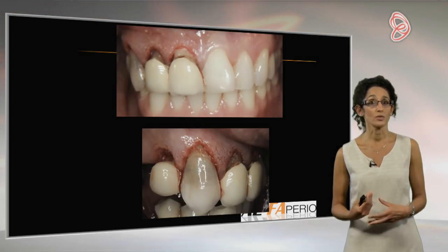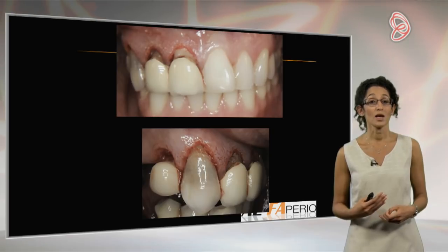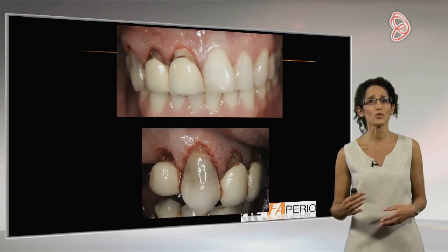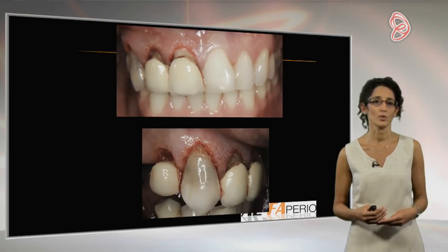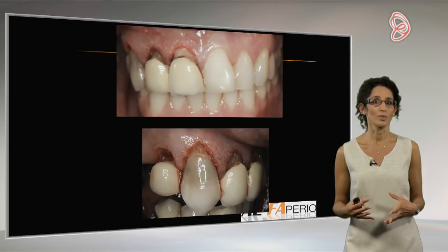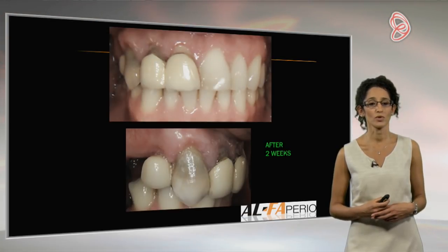So this is it after the bone and tissue removal. Again, I'm working freehand in this case, but you can see how we've tried to match up the gingival margins. And on the lower photograph, you can see how I've kind of gouged out the pontic area. But of course, we've done it with lasers, which makes it much easier to do. It would be very difficult to do that with a scalpel blade, and you would have to pack it. And of course, it'd probably be very sore and painful. So we've taken that out so ultimately they can have a nice long pontic, and we've done the bone removal.